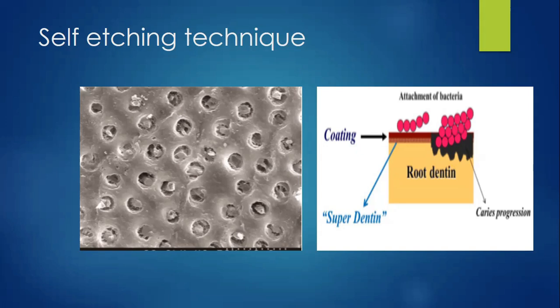As acetone, a volatile co-solvent, starts to evaporate, many small water droplets gradually emerge in the adhesive layer spontaneously and then disappear. But it takes several minutes, and entrapment of the droplets upon light curing becomes more likely. So this can compromise the strength. So a very strong air drying step is recommended in an acetone based system. Like we have One-Bond, which is acetone based, and Adper Single Bond, which is ethanol based. But studies have been done that say ethanol based systems are much better than acetone based systems, because acetone is volatile and evaporates faster and does not allow the collagen to re-expand.